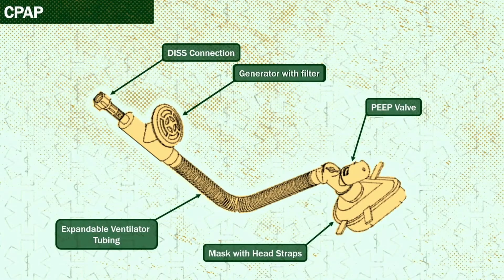Here's a diagram of a typical CPAP device that you may find in the back of your ambulance. It's very simple, it's very straightforward.